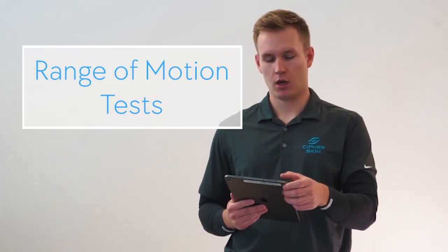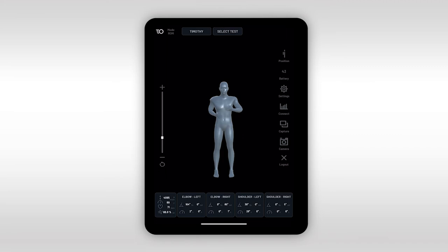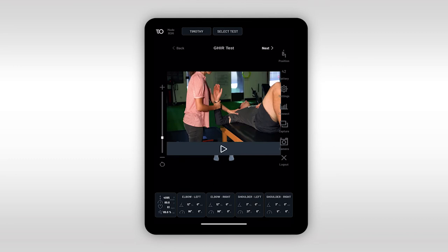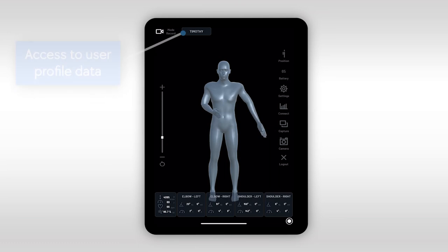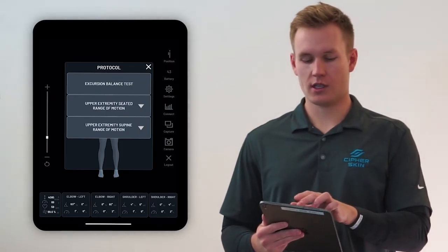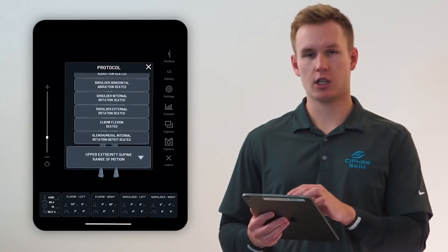Finally, we have the range of motion mode where we've automated a number of range of motion protocols that are commonly used in clinic. Whether during a live session or as part of a recovery program that patients perform by themselves at home, they can use automated range of motion protocols available in our library. Automated protocols are an easy way to guide a patient through an exercise — they are fully automated, completely safe, and easy to perform and understand. Data is captured and stored within a patient's profile which can be reviewed and analyzed at any time after a test. This data is exportable in a CSV file. Once in the range of motion mode we can select from our list of protocols, including upper extremity and lower extremity tests. All range of motion protocols can be reviewed in the replay mode.